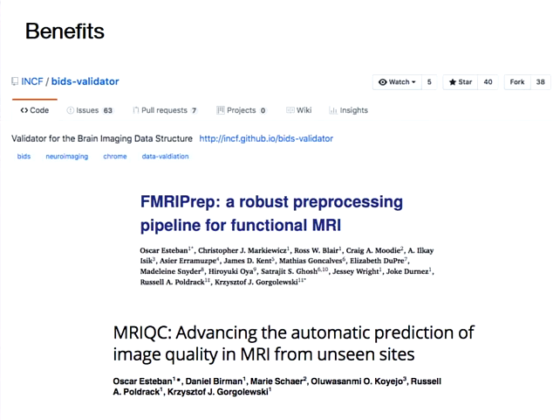If you haven't tried, it's really, really cool. The first benefit is that you can use the BIDS validator to test whether your dataset is compliant and if there are any problems with the JSON sidecar files and the headers. But then you can use all the amazing toolboxes that have been developed recently, such as fMRIPrep for preprocessing or MRIQC for data QA.